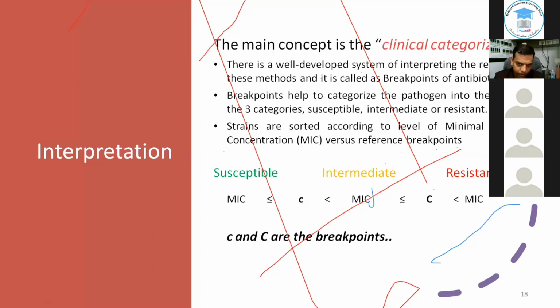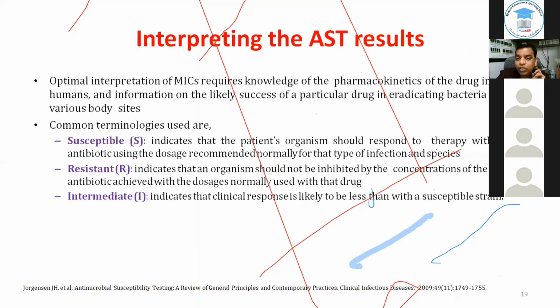In my lab, we always attach the breakpoint along with the reported organism. Along with the microbiology results, I always add a breakpoint so that the clinician finds it easy to interpret how sensitive or how resistant the organism is, and it helps them to rationally select the antibiotic. Breakpoints can also be made available in clinical stations like ICUs or PICUs to guide the clinicians, or on handheld devices like mobiles.